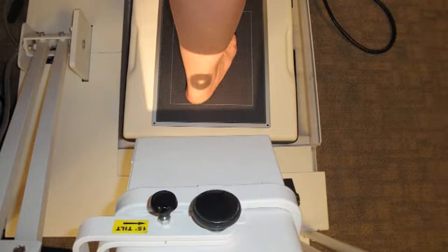With the knowledge to take these 5 views in your arsenal, you're now ready to obtain diagnostic X-rays for any foot concern.